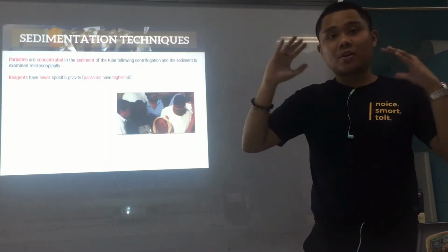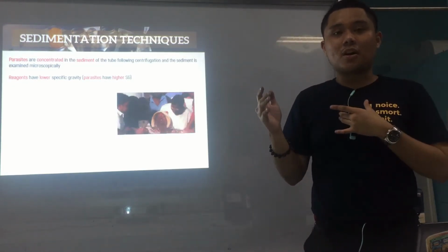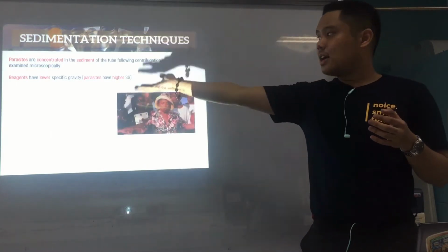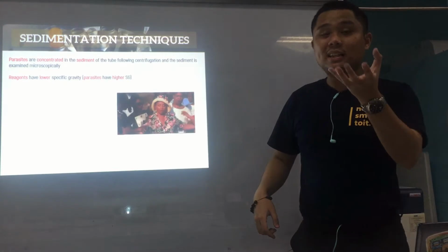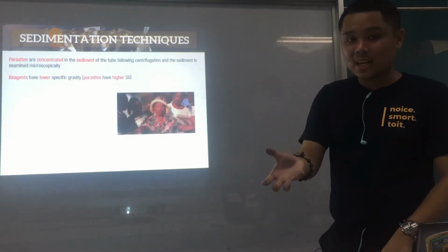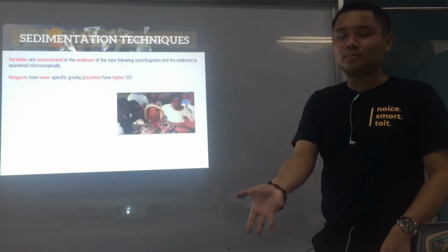Compared to the reagents, the fluid around the parasites, which are lighter, this facilitates the settling of the parasites to the bottom, to the sediment.